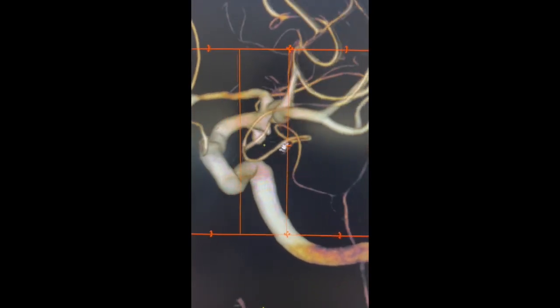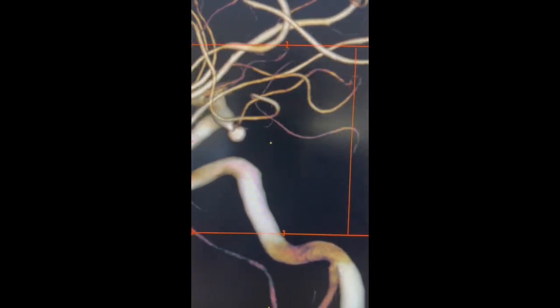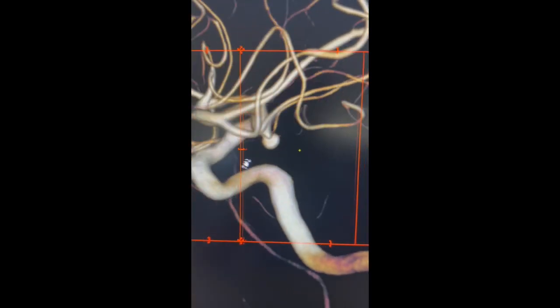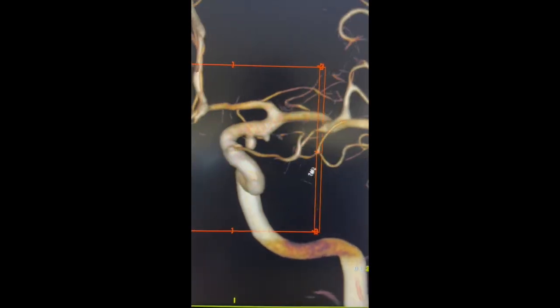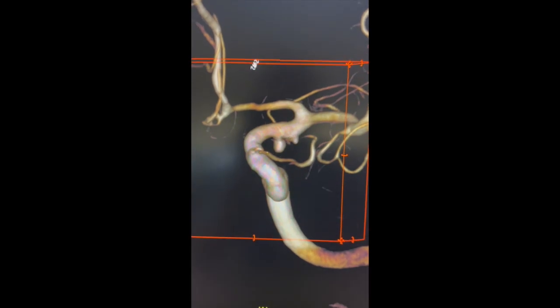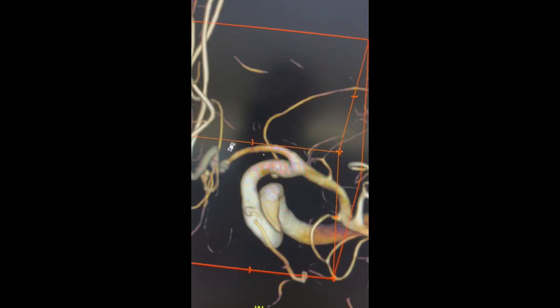The left posterior communicating artery aneurysm, which measured 2.8 by 2.6 millimeters, was treated also in a similar fashion with balloon-assisted coiling, but as you can see in the subsequent runs, the balloon was not actually utilized.